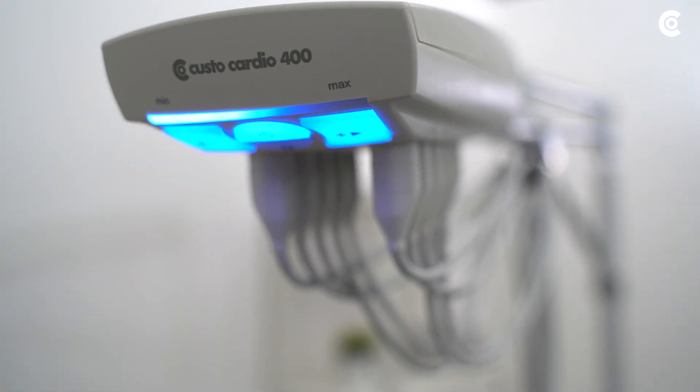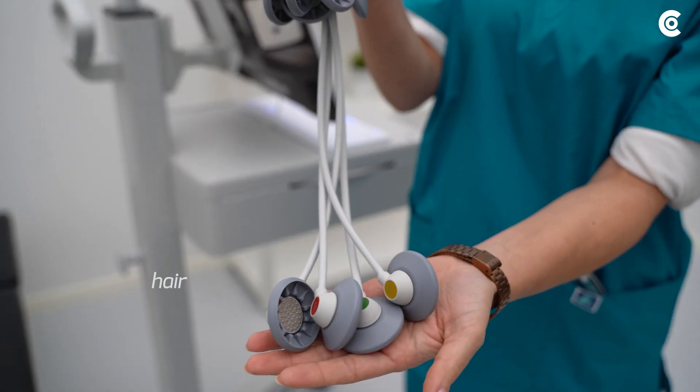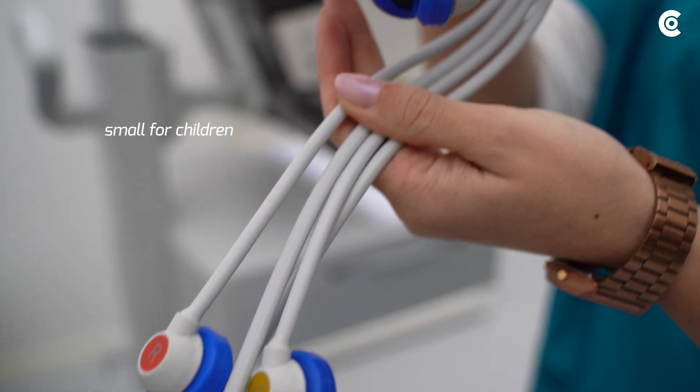If you perform the measurement with Cardio 400, decide on the right electrodes in advance. You can choose between the electrode type hair, standard, and small for children.